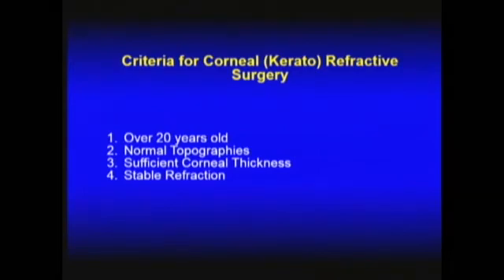Trying to resume the indications for the keratorefractive surgery, if you are going to consider keratorefractive cornea surgery for the patient, needs to be 20 years old. All the data, those are my personal parameters. Okay?